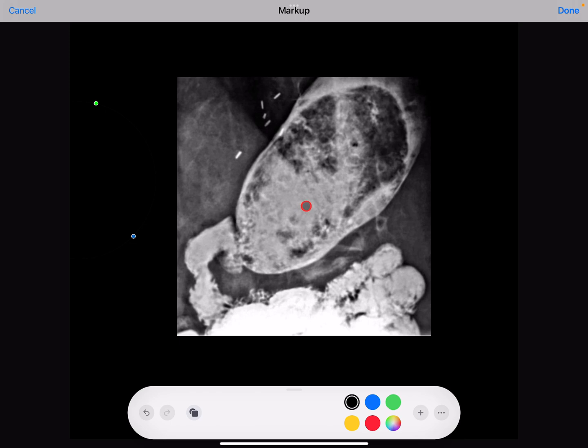And actually this patient was having peptic ulcer disease for which a Billroth 1 procedure has to be done, in which you can see there is direct communication of the distal end of the stomach with the duodenum, and the antrum part of the stomach has to be removed, and the remaining part is rejoined with the duodenum.